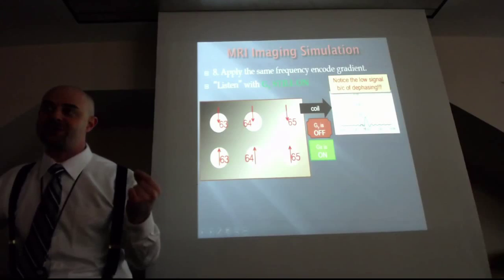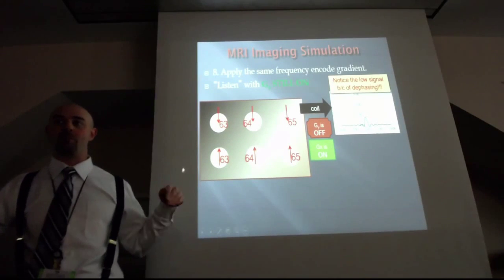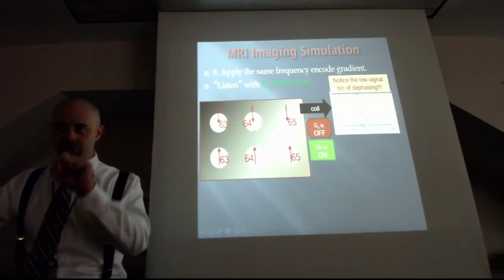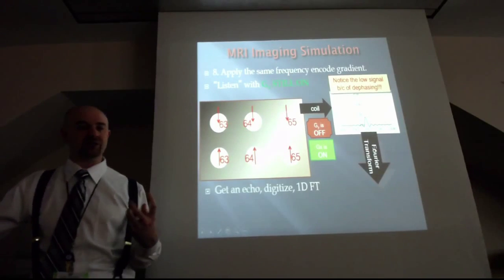Notice how much smaller the sinc function is. That's because these are now out of phase. So the bottom row and the top row signal contributions are canceling one another. So we get this more diminutive sinc function.